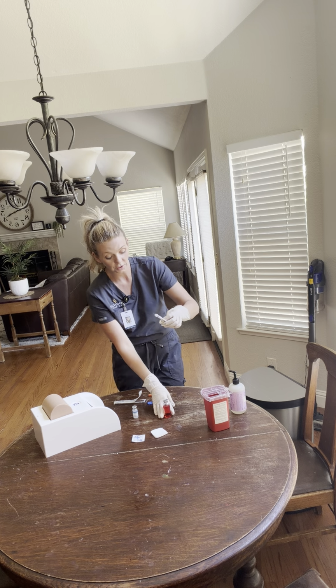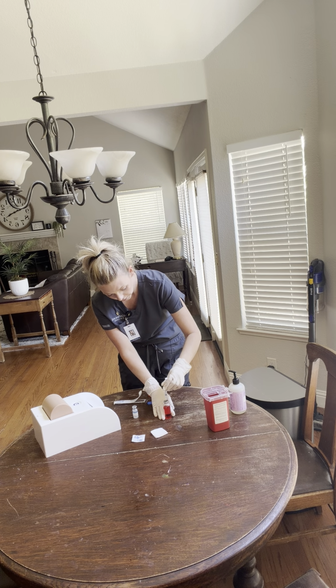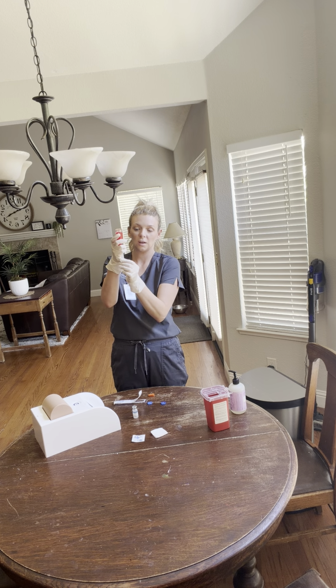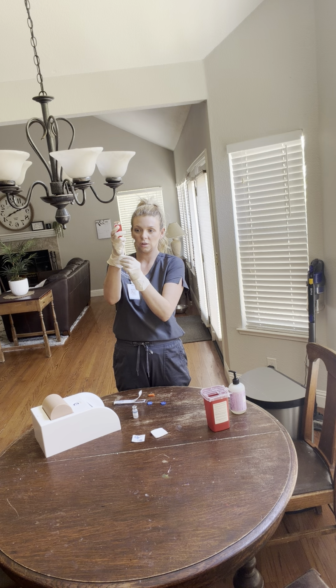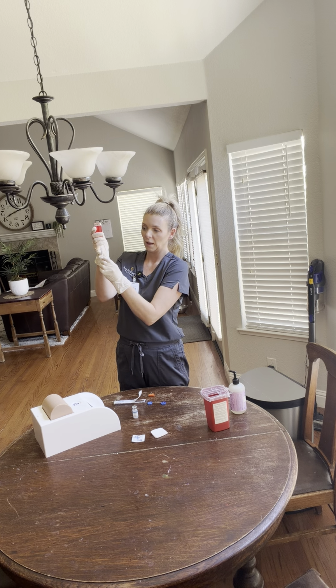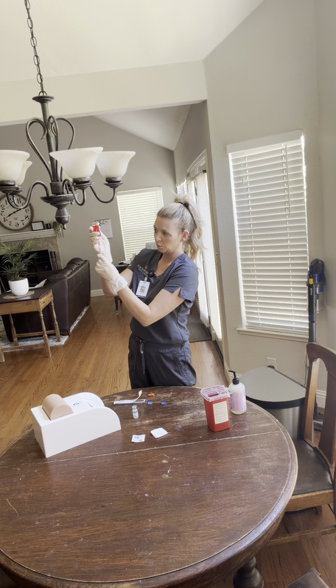And without administering any of this insulin, I'm going to inject this with my dominant hand directly into the vial. I'm going to invert, making sure none of this medication goes into the NPH, and I'm going to draw up 8 units of NPH so that my syringe will show 12 units altogether.